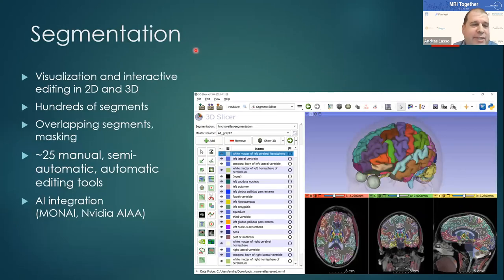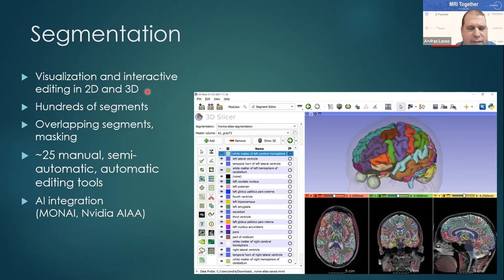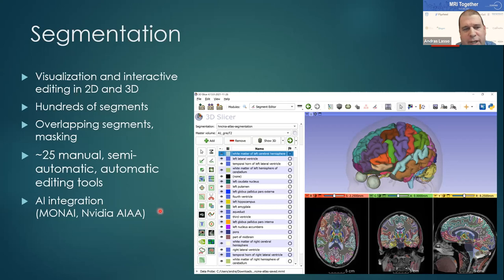Segmentation is one of the most frequently used features of Slicer. You can not only visualize but also interactively edit segmentations or labels both in 2D and 3D. It supports hundreds of segments, including overlapping segments. There are dozens of manual, semi-automatic, and automatic segmentation tools, including AI-based tools contributed by developers of the MONAI toolkit and also Nvidia.